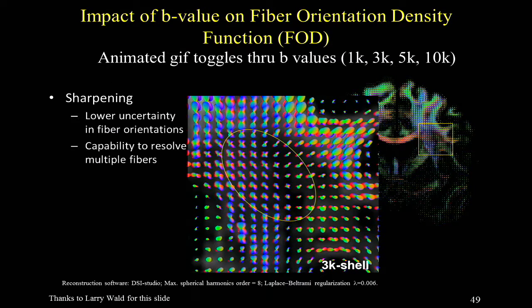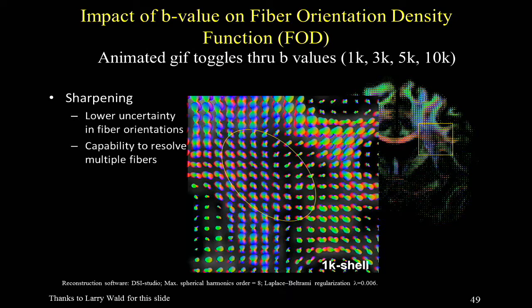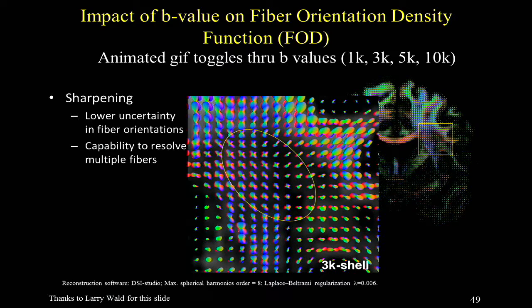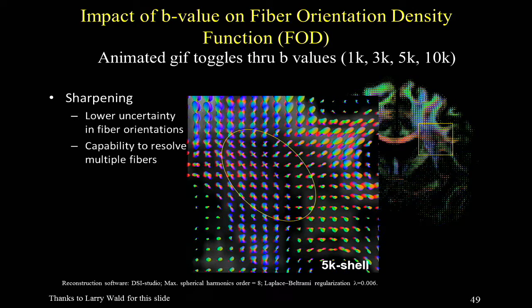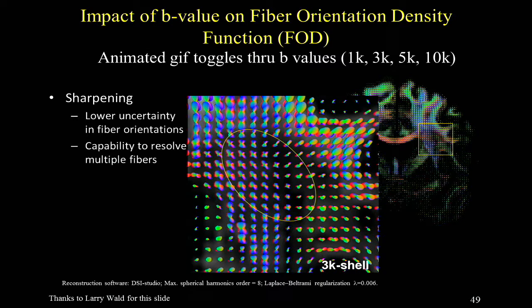Okay, on to connectional analysis. I wasn't sure how much people know about diffusion MRI, if people in general know what's going on with diffusion. So this is actually a GIF that Larry Wald gave me. This is from our Connectome scanner, which is a 300 millitesla per meter scanner we have in Charlestown. It's an astonishing technical feat that Larry and Siemens accomplished in order to get this thing working.